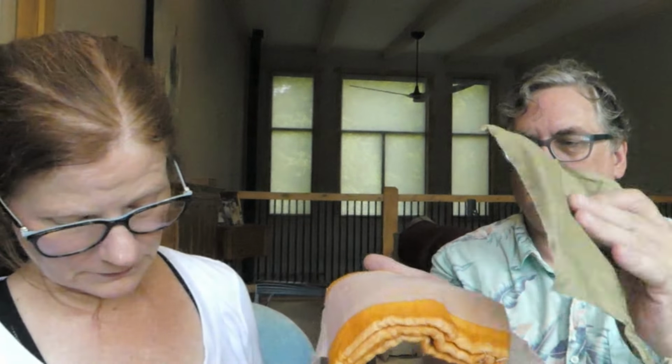It was cleverly designed. You could do this if you're in wet conditions or radiation conditions and you want to make sure nothing gets into the wound itself. Put this on and then put this on the top of it, and then you've got so much of this you would have no trouble covering it up, where it keeps some of the leakage in. And if you do break the black ties, which you can easily do by hand, you have a very nice large dressing.